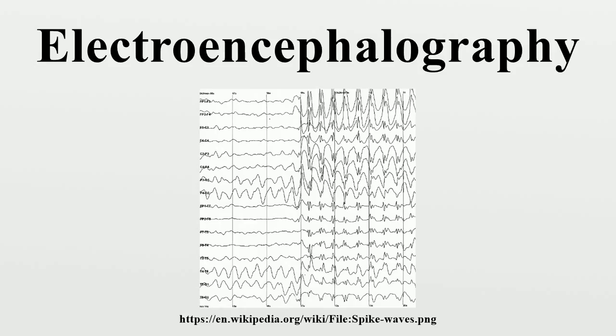EEG sensors can be used in more places than fMRI, SPECT, PET, or MEG, as these techniques require bulky and immobile equipment. For example, MEG requires equipment consisting of liquid helium-cooled detectors that can be used only in magnetically shielded rooms, altogether costing upwards of several million dollars, and fMRI requires the use of a 1-ton magnet in, again, a shielded room. EEG has very high temporal resolution, on the order of milliseconds rather than seconds.